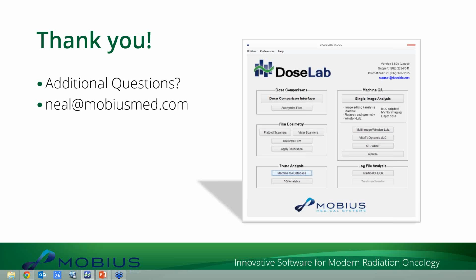Question about getting the Elekta MLC files. So you're talking about the log files. We actually have a special piece of software that we include with the system, and we'll help you set up. As I was telling someone earlier today, it takes about 30 seconds to set it up, and it basically goes in and grabs the log file data directly from the Elekta machine, and then does the analysis for you.